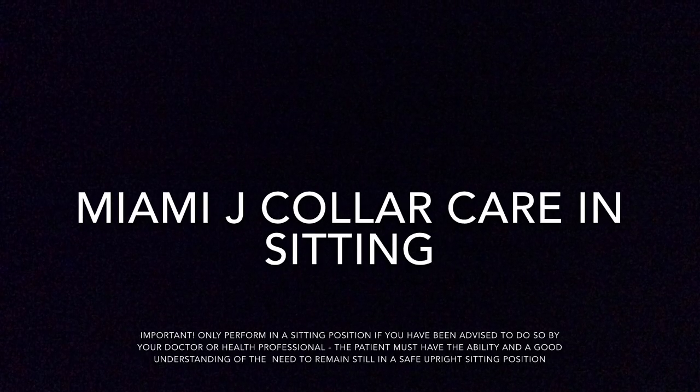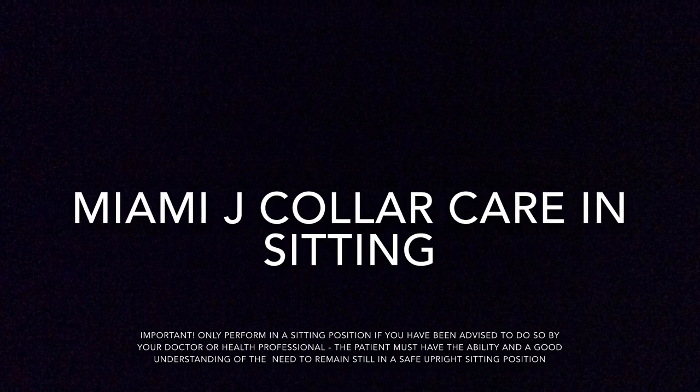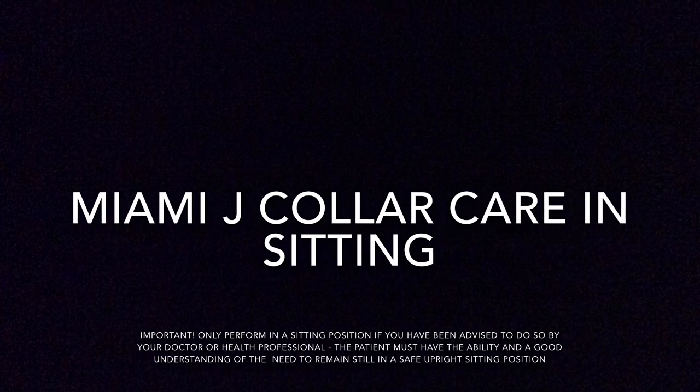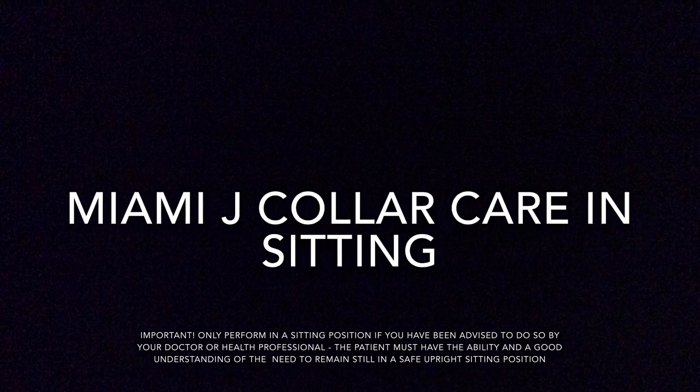This short video explains how to perform collar care with patients wearing a Miami J cervical collar. Collar care is extremely important to avoid breakdown of skin and prevent pressure area development.